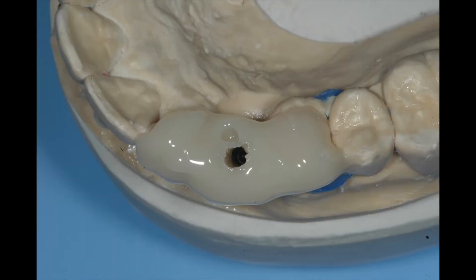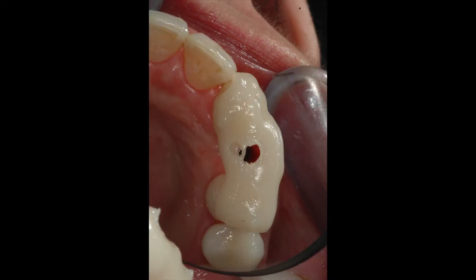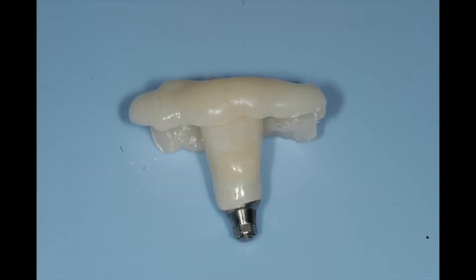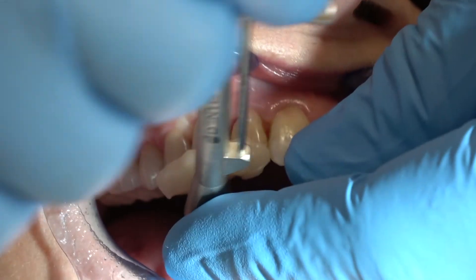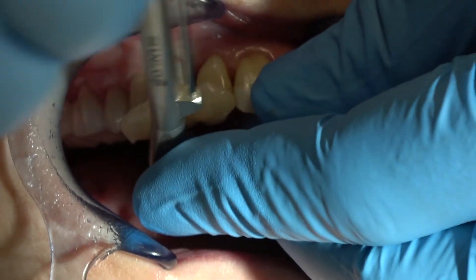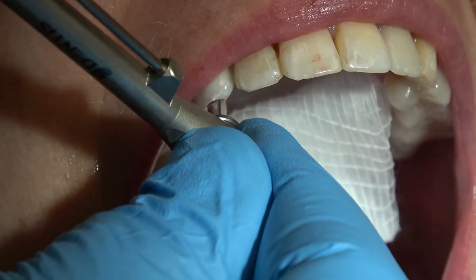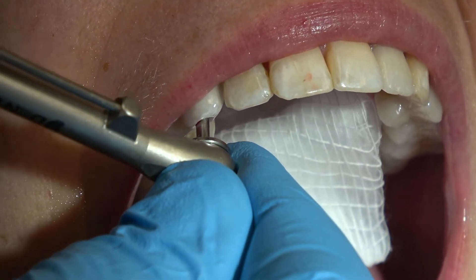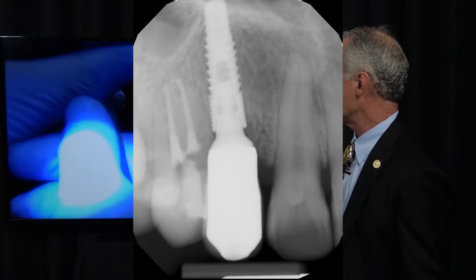Your lab can make one out of Duralon, or you can make one yourself. Here's showing how it fits the adjacent teeth. I've placed the crown in the jig, put it all in place, and I'm screwing it in. Now I'm tightening to 35 newton centimeters, and I know it's seated perfectly because of the seating jig. Take a radiograph to confirm.